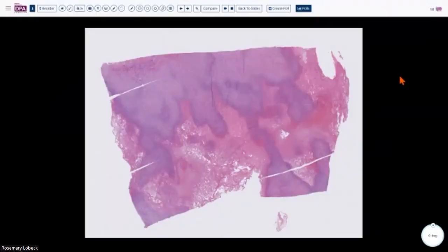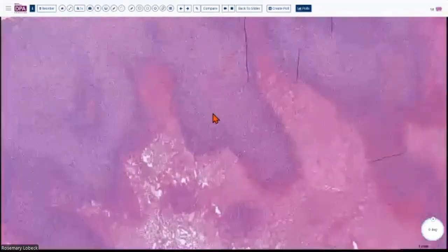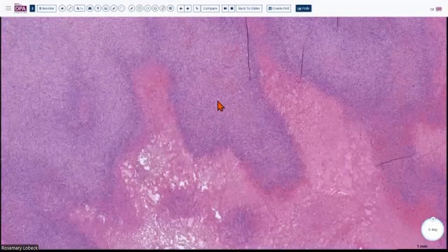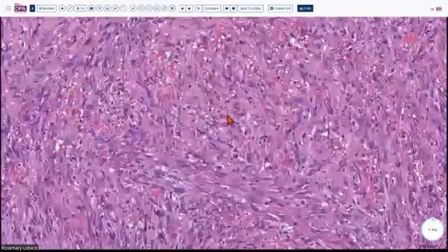So I want to finish with a couple more pseudosarcomatous proliferations. So this is a patient who unfortunately had a testicular torsion and couldn't come to the hospital for a few days. And so when they resected his testicle, they found a large soft tissue-like mass around the torsed testicle, which was completely non-viable. And from a low power, you can see here that there is a huge hematoma, which is trying to resolve. And on the borders of the hematoma, you can see this spindle cell proliferation. So this, in fact, is an exuberant myofibroblastic or a wound healing type of proliferation that you find adjacent to areas of a hematoma. But when I zoom in, you will see why this can be so difficult, right?